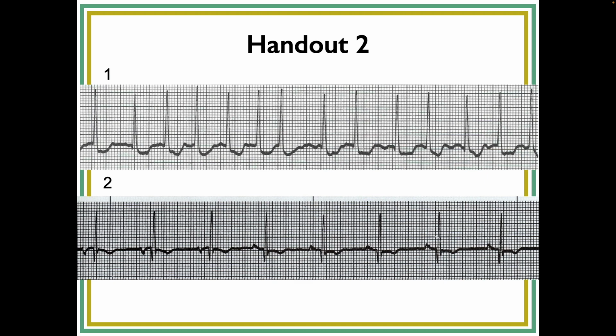They are within 3 to 5. And then the QRS complexes. They are narrow. So everything seems kind of normalish except for those weird P waves.